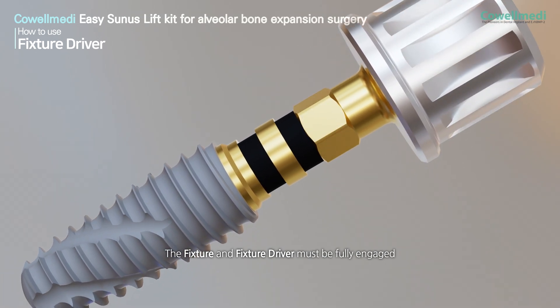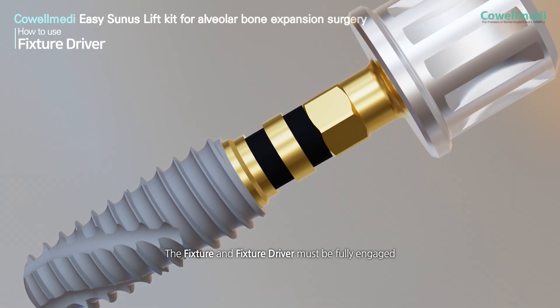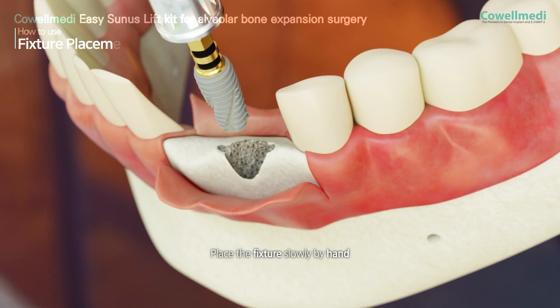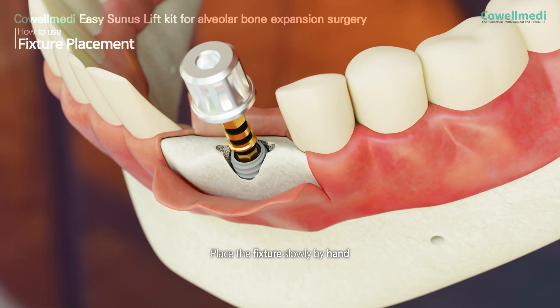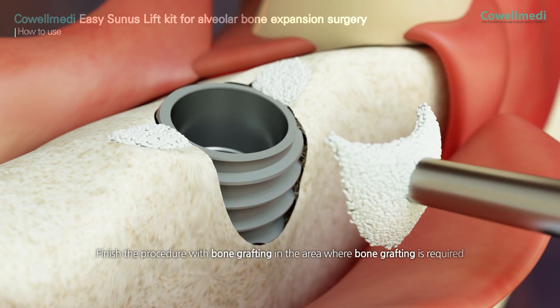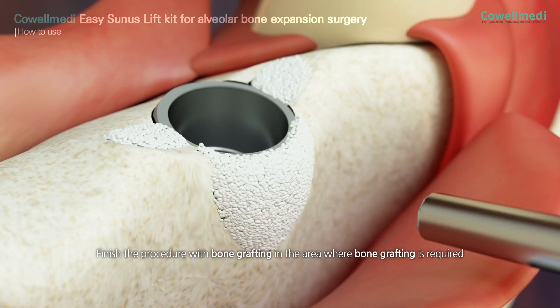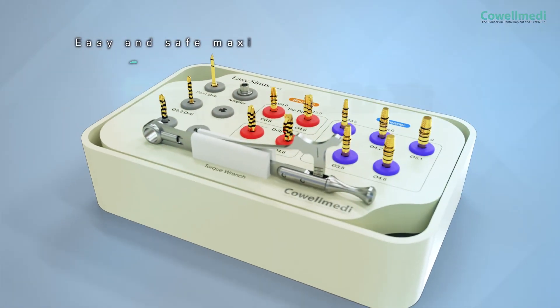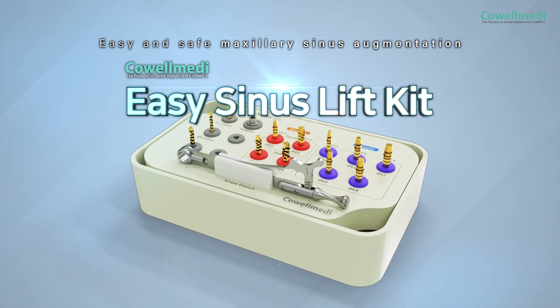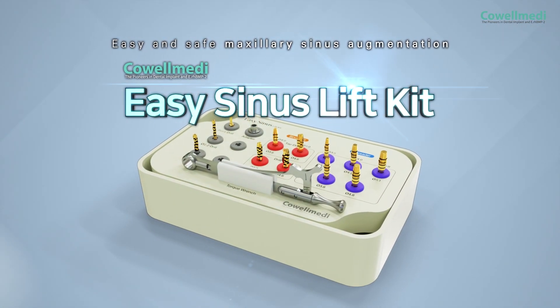Place the implant according to the manufacturer's manual — the fixture and fixture driver must be fully engaged. Slowly insert the fixture by hand, then finish the procedure by placing bone graft in any area where bone grafting is required. Easy and safe maxillary sinus lift with Coel Medi's EZ Sinus Lift Kit.